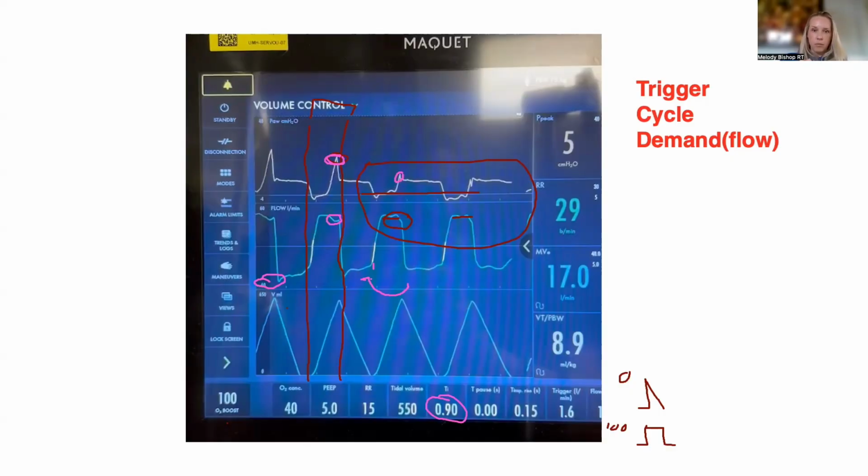Interesting. So what if some junior attending like myself comes along and says, Melody, I'm going to paralyze the patient because the vent's out of hand. He's too tachypneic, he's agitated. What possible issues could we run into if I did that?